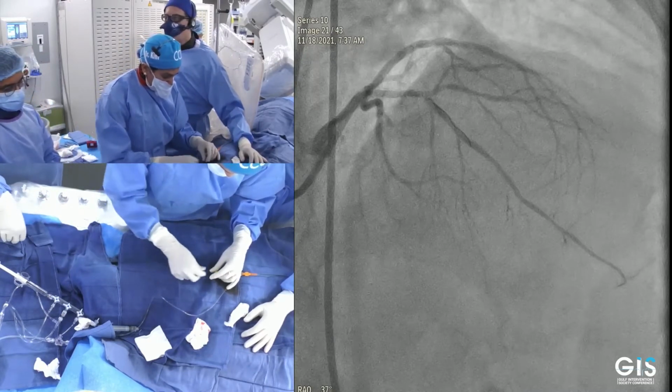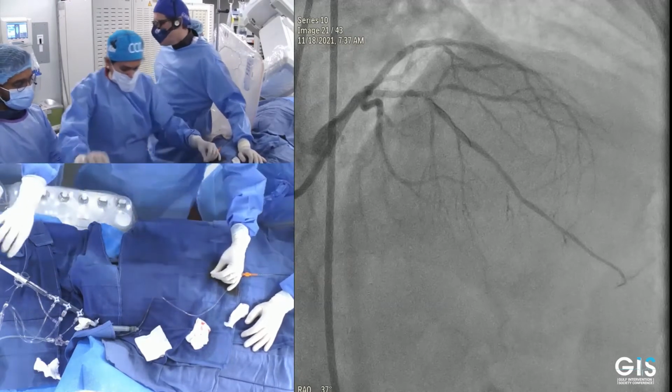Yeah, pretty much. With the orbital, you have to be very careful with proximal tortuosity.